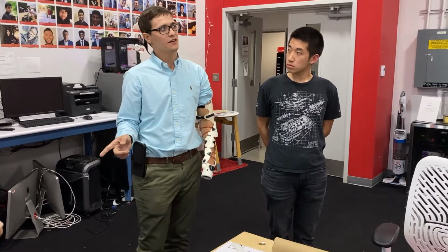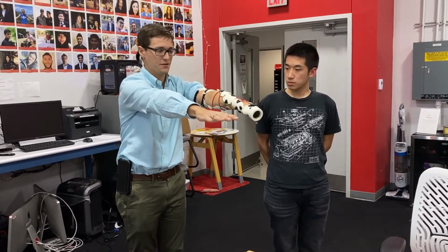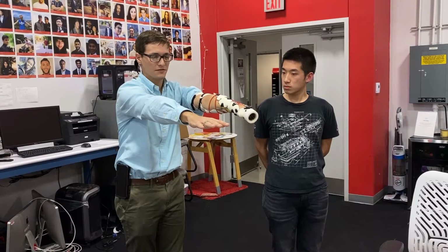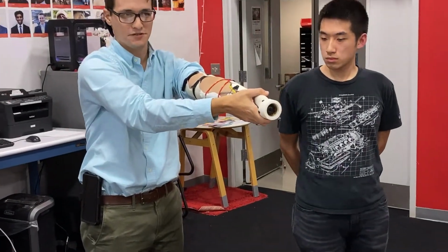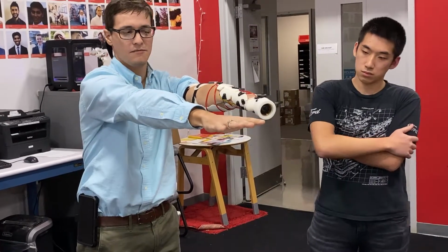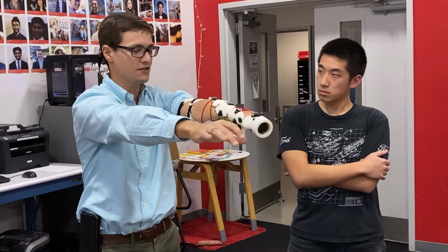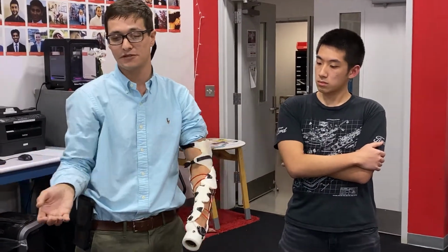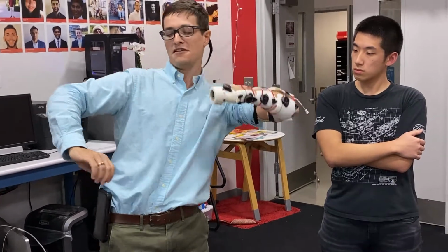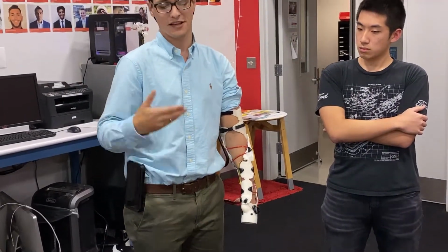You highlight another point too. As a wrist disarticulation amputee, one thing that we have to consider is arm length. Now, if you're putting something on top of a distal appendage that's there, you may get some symmetry, but chances are you're going to put a handle there that doesn't fully match the length. So in terms of getting used to some tweaks and then learning how to use it, I think that's something that can play into that.